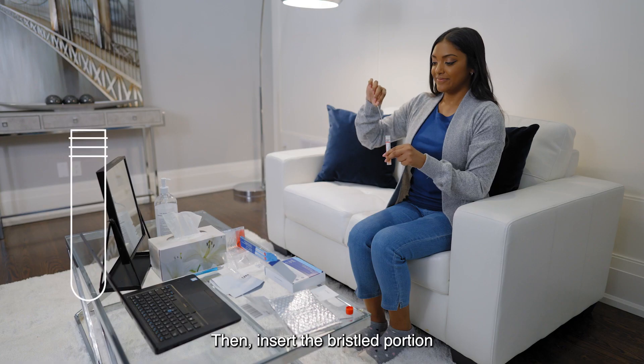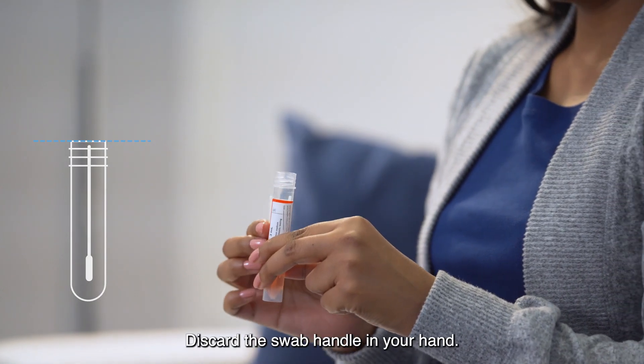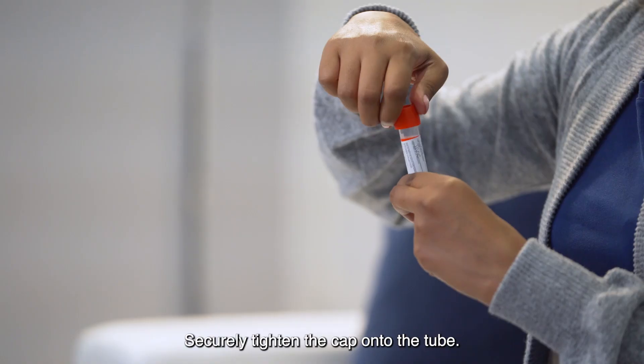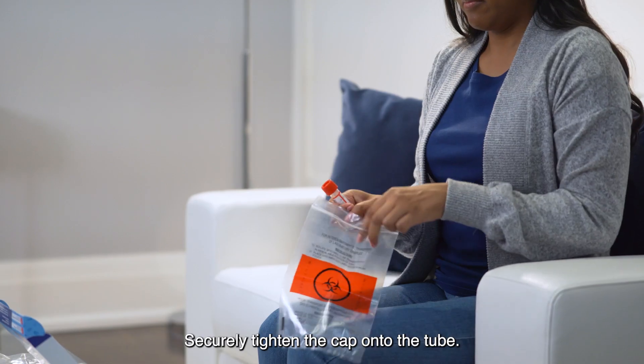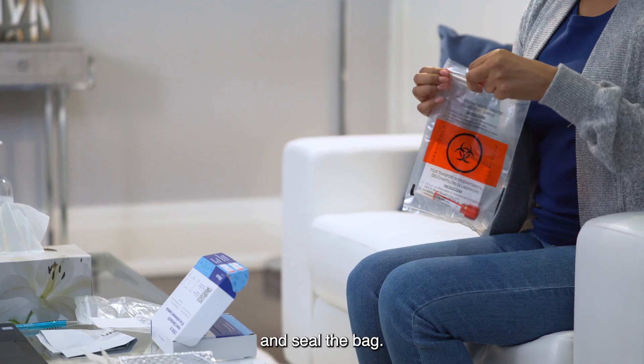Then insert the bristled portion of the swab into the tube up to the score line and snap it off. Discard the swab handle. Securely tighten the cap onto the tube.